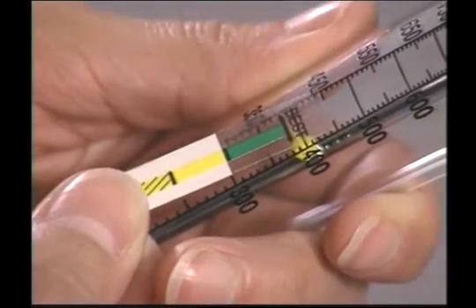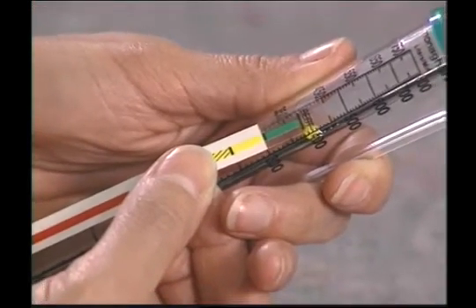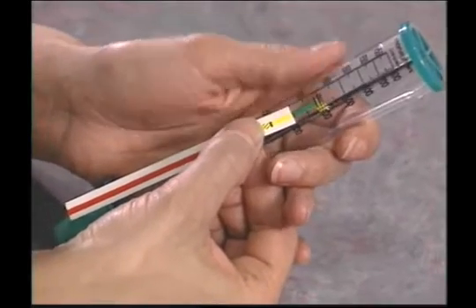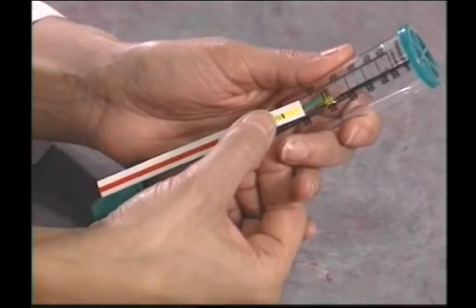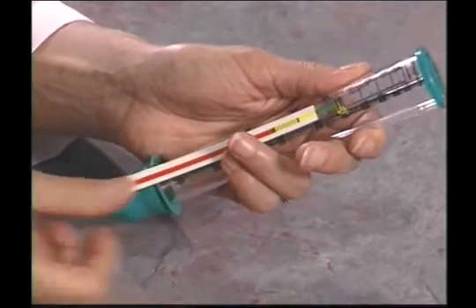physician. Your physician or licensed healthcare professional should apply your color zone tape. They will remove one tape from the sheet of tapes provided, then peel the backing from the green zone area. He or she will then place the tape in the middle of the TruZone PFM scale, so the arrows below the word best line up with your best peak expiratory flow.